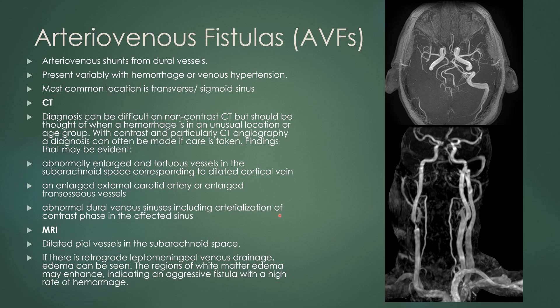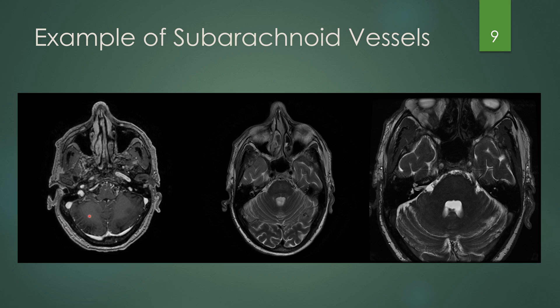You can see abnormally enlarged and tortuous vessels in the subarachnoid space, especially corresponding to a dilated cortical vein. You can get an enlarged external carotid artery or transosseous vessels, and abnormal dural venous sinuses with arterialization of the sinus. On MRI, you can see those dilated pial vessels in the subarachnoid space and edema if there is retrograde venous drainage through leptomeningeal branches — this edema can enhance, indicating a more aggressive fistula. You see flow within venous structures on the side with the abnormal connection. Here are examples of subarachnoid vessels along the ventral surface of the brainstem, with too many flow voids on T2, indicating an abnormal arteriovenous connection.